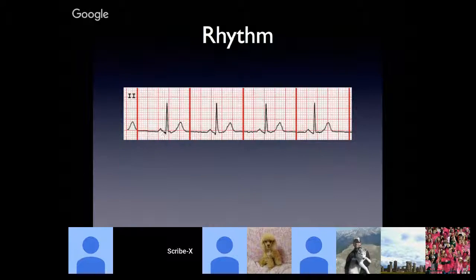There are no isolated P waves doing their own thing. They are all tied to QRSs, at least on this rhythm strip that I'm seeing. Furthermore, there is a QRS right after every P. PQRS, PQRS, PQRS. There are no QRS complexes hanging out without an attendant P wave. So I can say, at least based on this strip, that this is normal sinus rhythm.